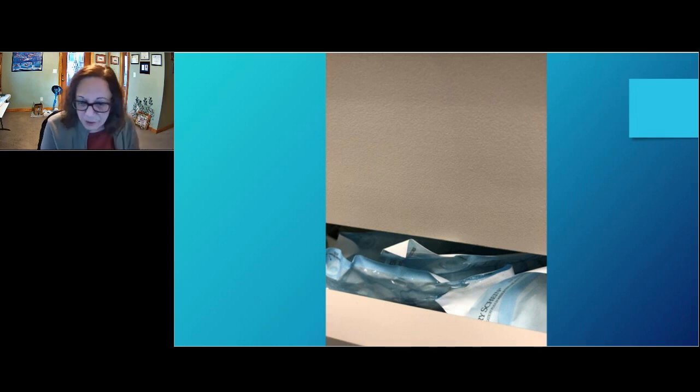I don't know how else to put it. There should be no pressure on the packaging, particularly peel pouches, because when you squish it, you could potentially be forcing air out.